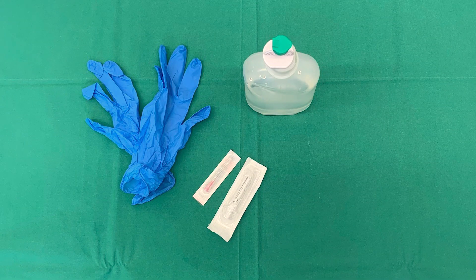Needed for the skills lab exercise are gloves, a cannula in an adequate diameter, a syringe, and injection fluid. The subcutaneous injection is an often performed injection procedure on sheep due to the low risk of an abscess forming out of contamination and infection with anaerobic bacteria.